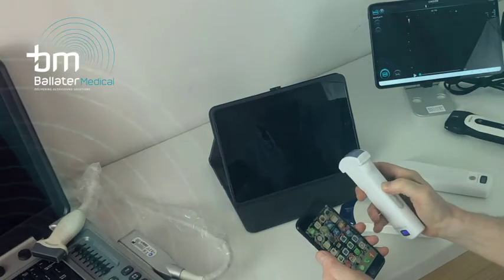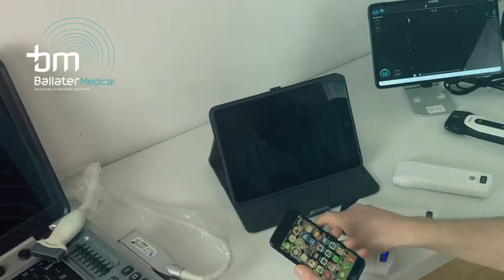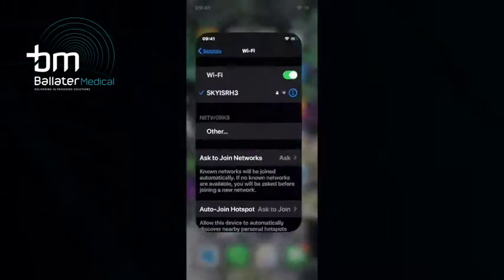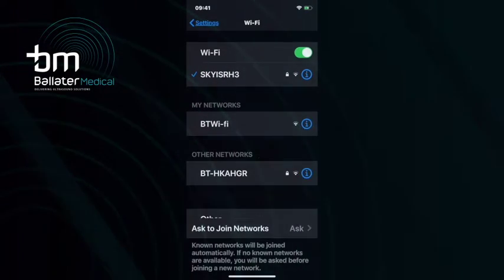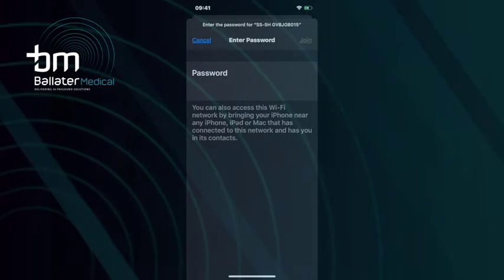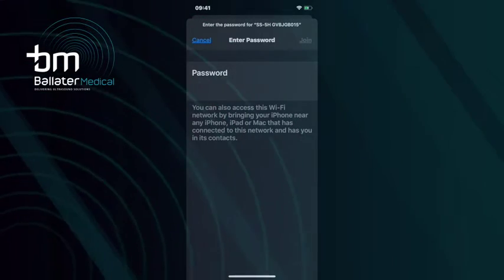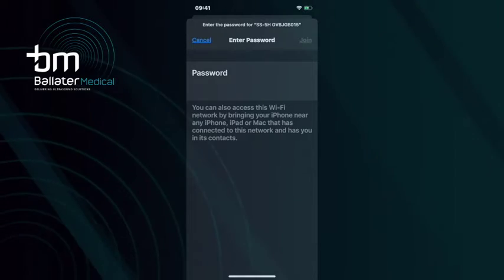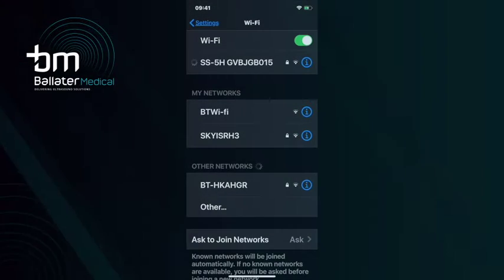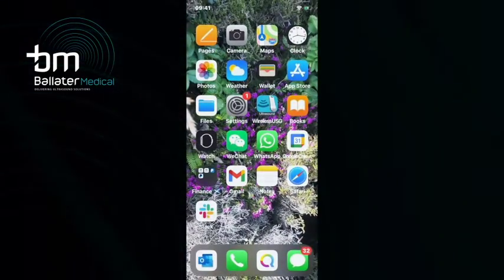So switch on the device. You'll see the flashing light at the bottom of the probe. It's telling you that the Wi-Fi setup is starting. Then go into settings on your phone and look for the Wi-Fi network connection. Select that network and enter the password, which corresponds to a 10-digit number that you'll find on the back of the probe at the bottom. So having entered in your 10-digit password, that will then allow you to connect to the wireless network. There it is connecting now. You join the network.